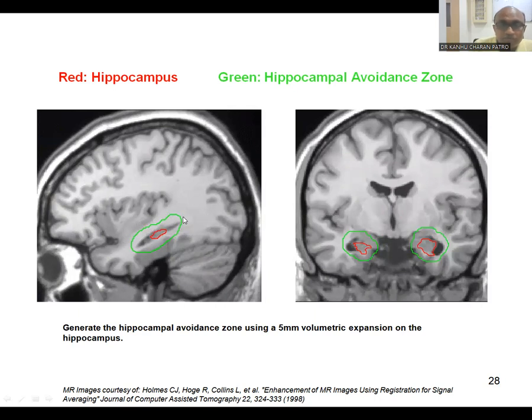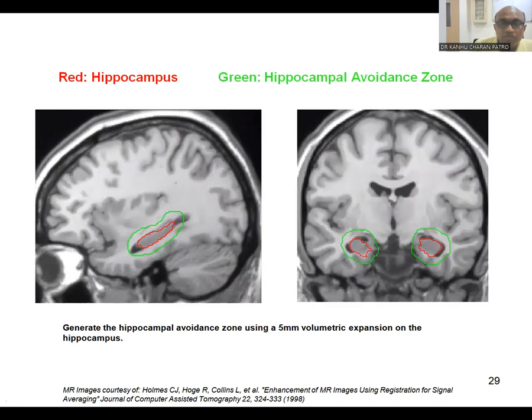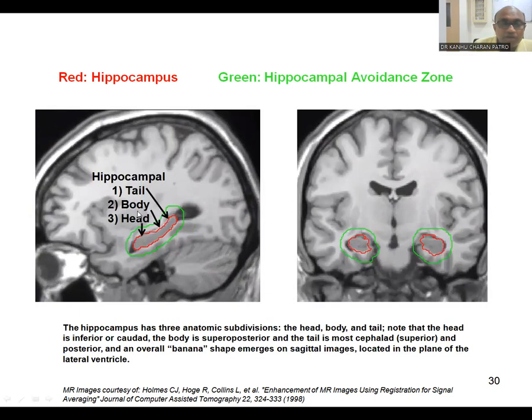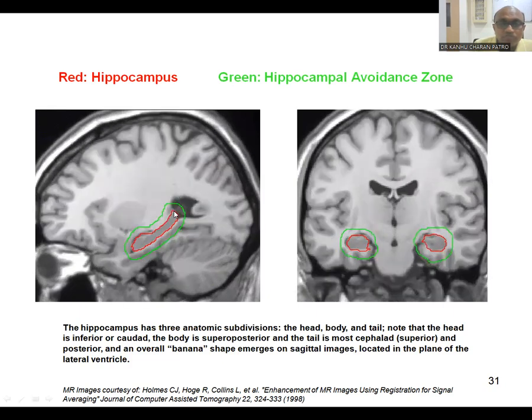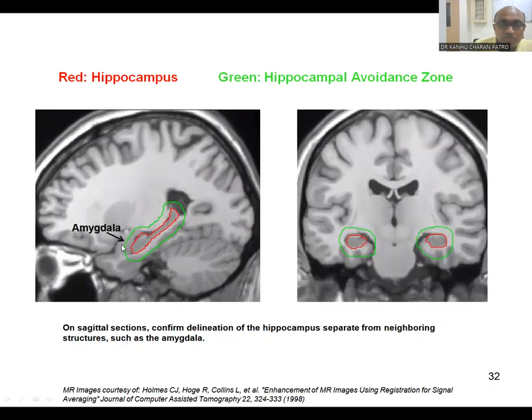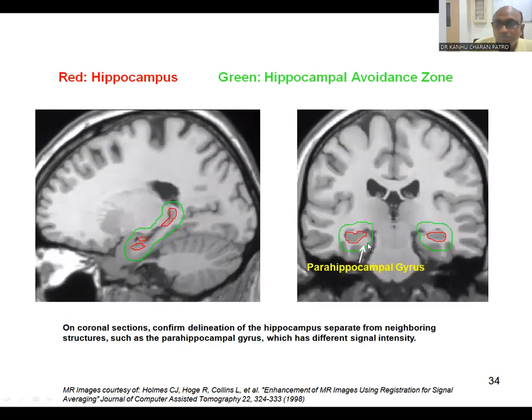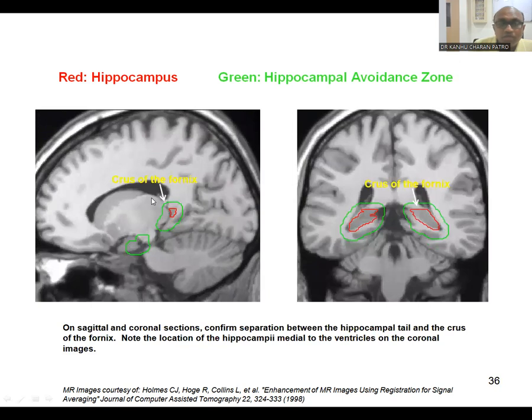You have to give a 0.5 centimeter margin around the hippocampus — this is called the hippocampus avoidance zone. The green represents the hippocampus avoidance zone and red is the hippocampus itself. It looks like a solid, obliquely placed, banana-like hypointense structure. Anteriorly is the head, the middle is the body, and posteriorly is the tail. The amygdala part should not be contoured. The parahippocampal gyrus and fornix should also not be contoured.